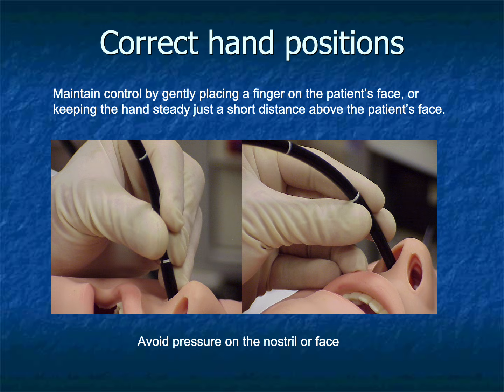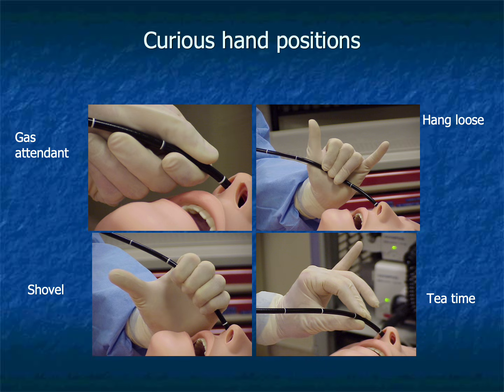Even hand position deserves attention. The bronchoscopist learns to avoid unnecessary pressure on the patient's face while maintaining stability and control. These examples of unusual hand positions shown carry a deeper point. They are not only humorous. Technique evolves through correction. One first develops habits, then awareness, then refinement. And it is harder to break a bad habit than to acquire a good one.